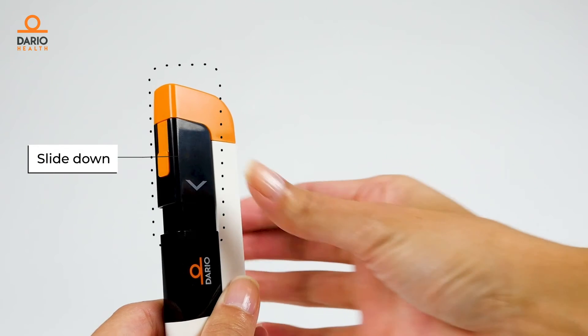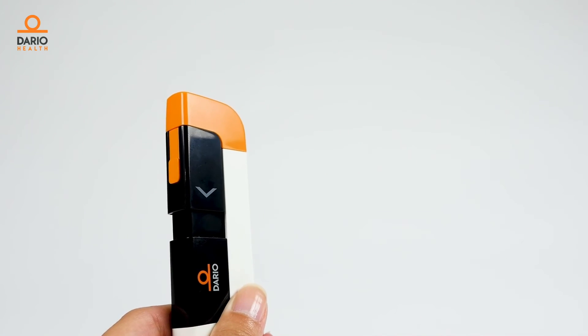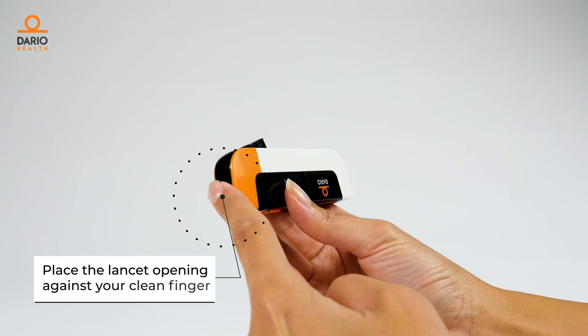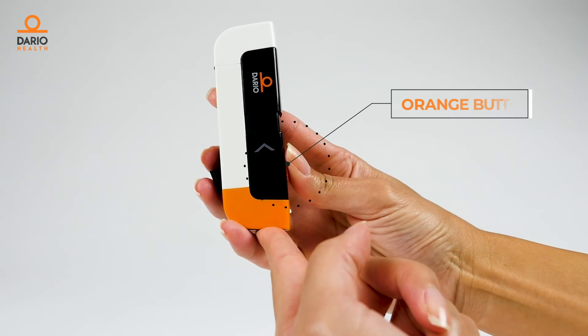Now let's prime the lancet. Slide the bar marked with the arrow down as far as it will go. Place the lancet opening against your clean finger and press the orange release button to draw blood.